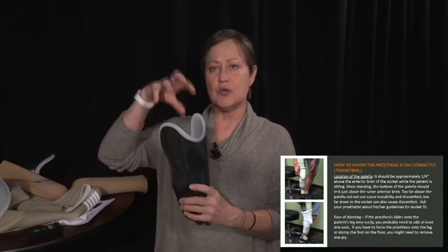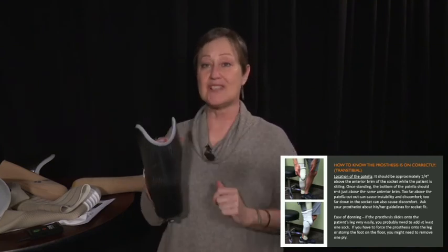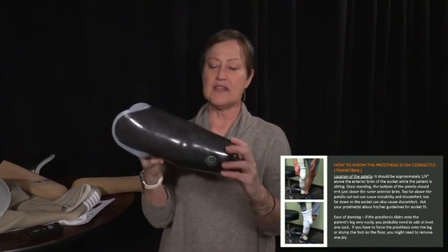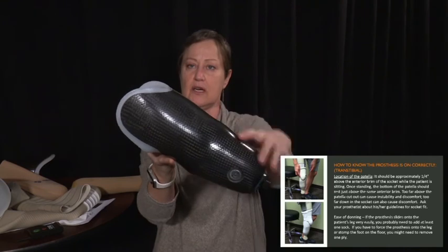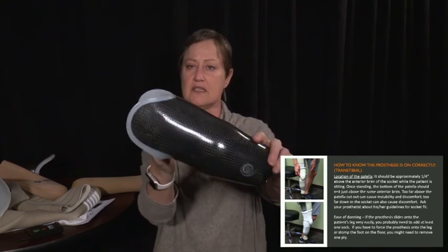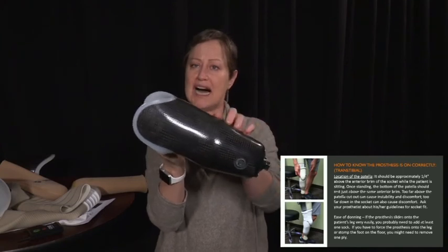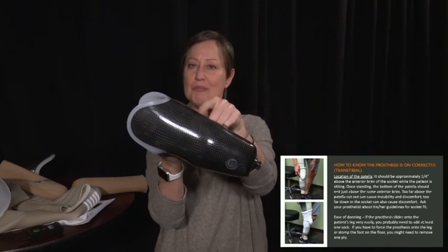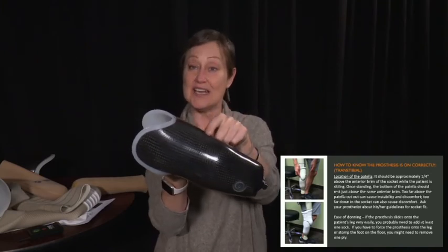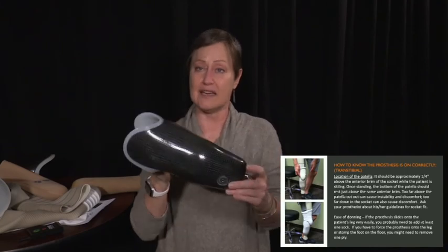If they are too far above, if they wear too many socks, they're going to be up here somewhere. And if you think about this being a custom socket, this one has a nice relief here that was put in for the distal tib of this patient. If the patient is too high in this socket, where this relief was, now that bony place is up here, and it really hurts because it's not matching where the relief is in the socket.